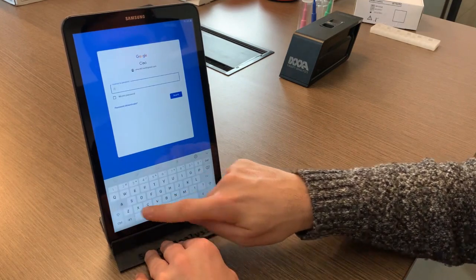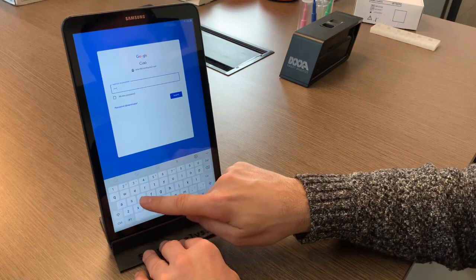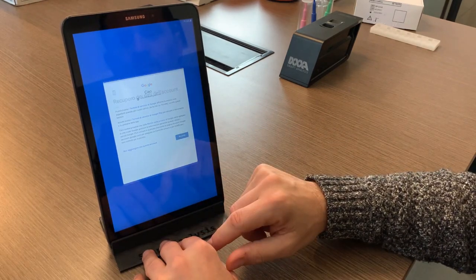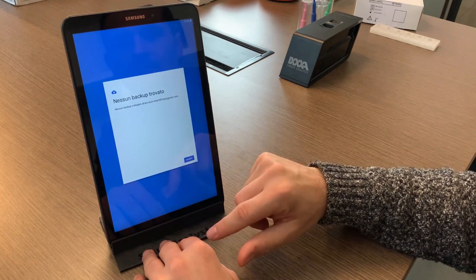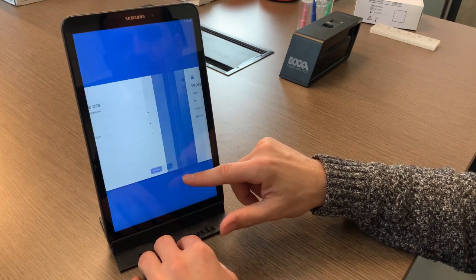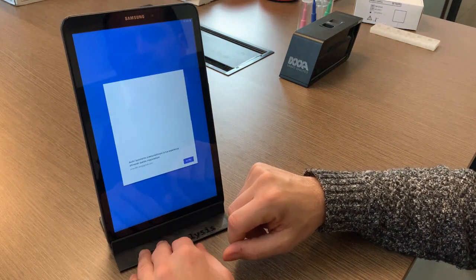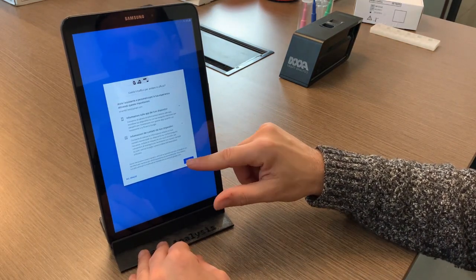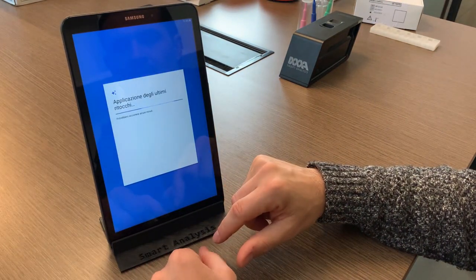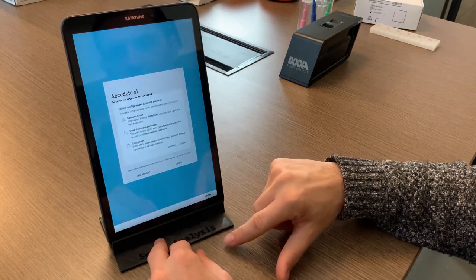Once you have entered your account you can continue by following the display on the tablet, accept all the conditions, and at the moment when it asks you to create a Samsung account you can skip this step, because it is not necessary.